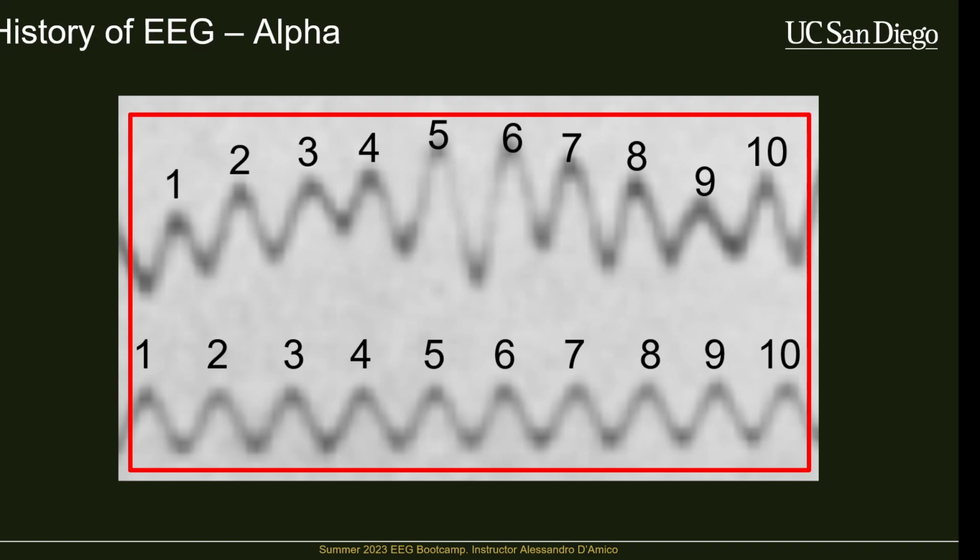It's very reliably generated, which is why I knew it was going to be a good control signal. Essentially, there's different types of activity. There's some stuff that is sort of universal and can be generated without a complex task. So in this case, all you have to do is close your eyes and relax, and you can generate it.